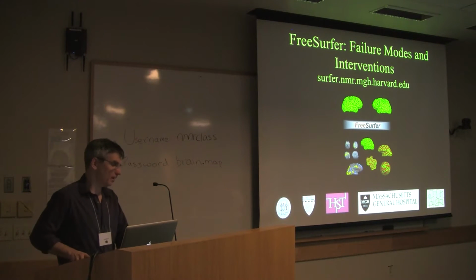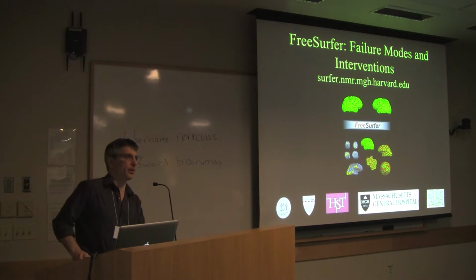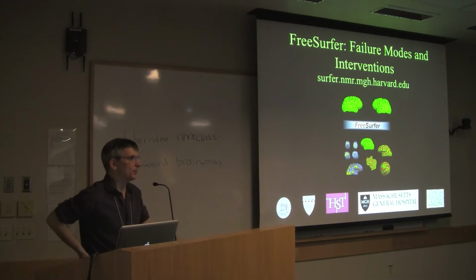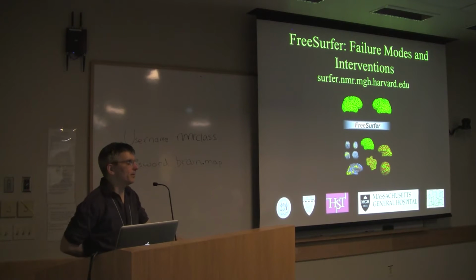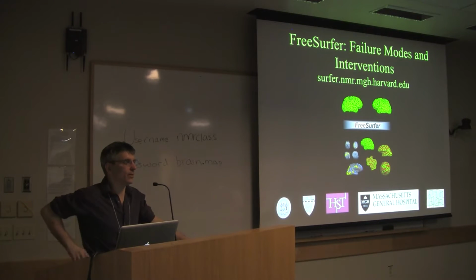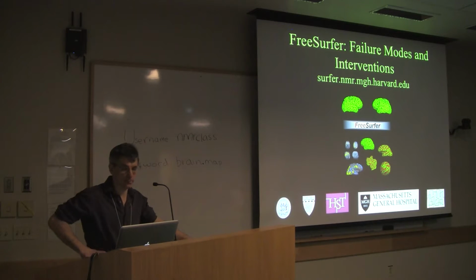Okay, so as Bruce mentioned this morning, this talk is what we internally refer to as the scare talk, because we just showed you all this nice, fully automated stuff, and now we're raising the specter that some of the things could actually fail. And so there are certain things that you have to check on and ways to actually fix it if they are failing.